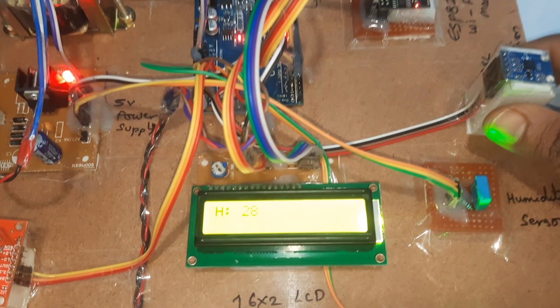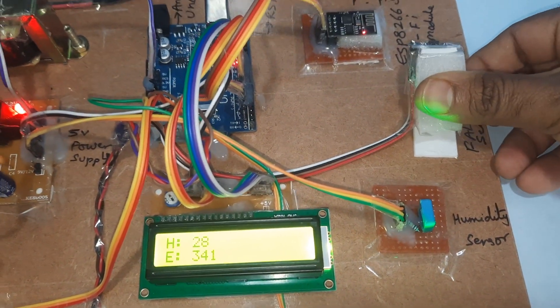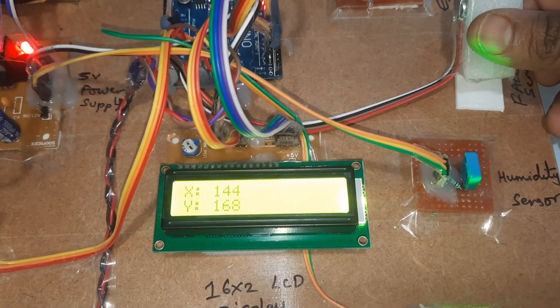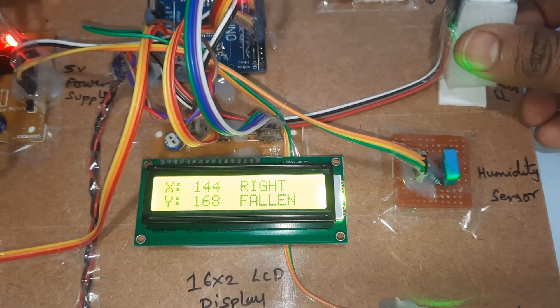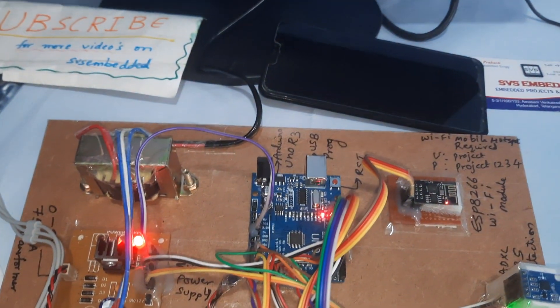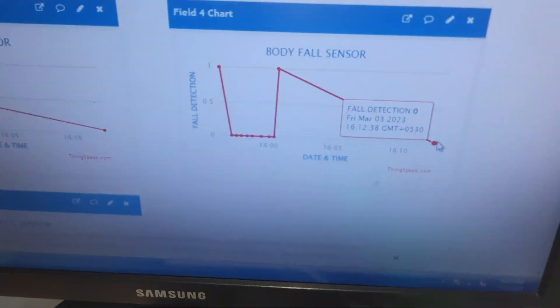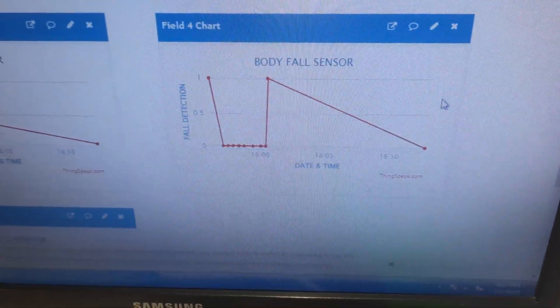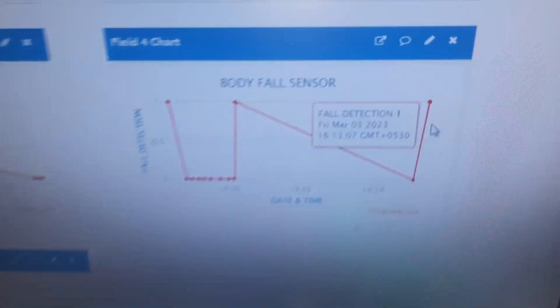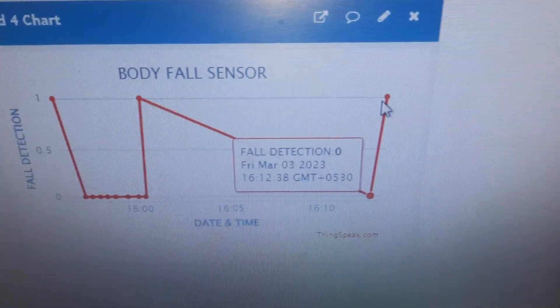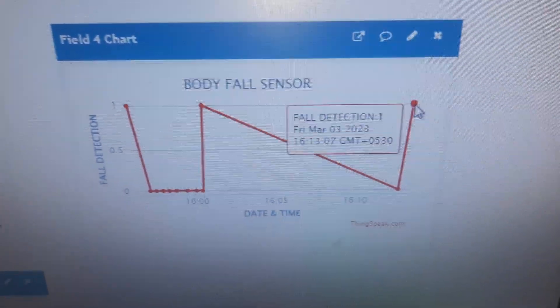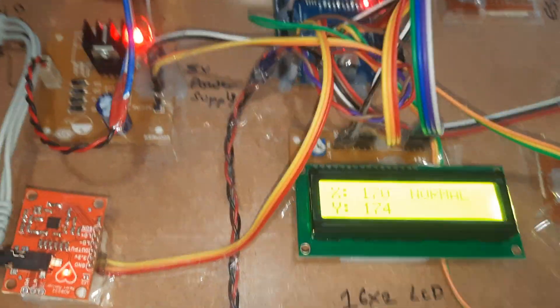Now I'm going for the fall detection. Right fallen - so we will get the fall detection here. It should go to high. Yeah, fall detection is detected.